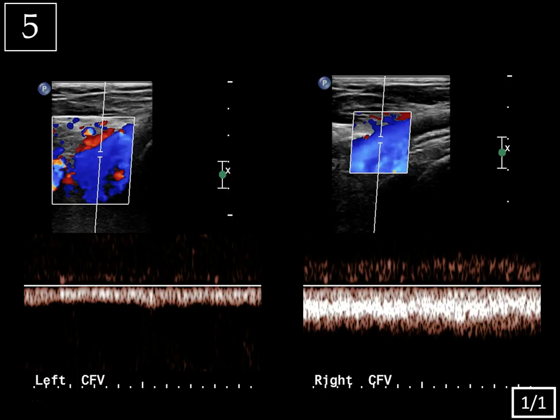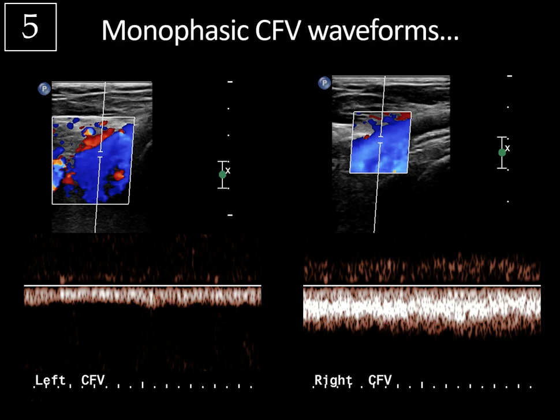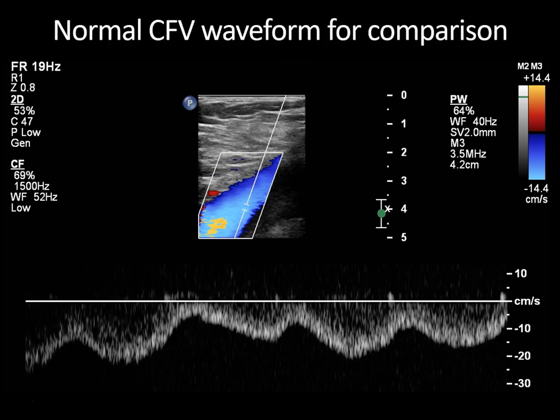Last case: bilateral common femoral vein color and pulse Doppler. The color Doppler images show that the common femoral veins are patent bilaterally with no thrombosis, but the waveforms are a bit unusual — they're monophasic, meaning they have a non-pulsatile homogeneous flow pattern. To compare, a normal common femoral vein waveform has this normal respiratory variation with an undulating contour, because increasing and decreasing intrathoracic pressures from breathing get transmitted to the central veins and then peripheral veins, giving that normal wavy appearance.